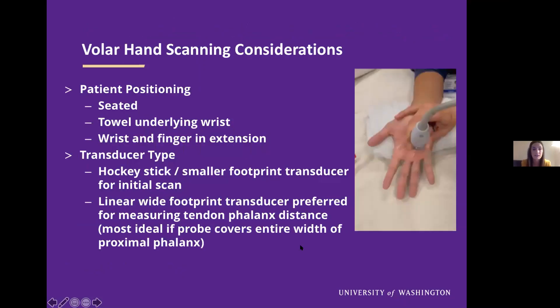For scanning considerations: our patient position — we prefer them to be seated with a towel underlying their wrist and the wrist and finger in extension. For transducer type, we use two different transducers. We use a hockey stick or smaller footprint transducer initially, and then switch to a linear wider footprint transducer for measuring our tendon-phalanx distance or tendon-bone distance. It is most ideal if this probe covers the entire width of the proximal phalanx.